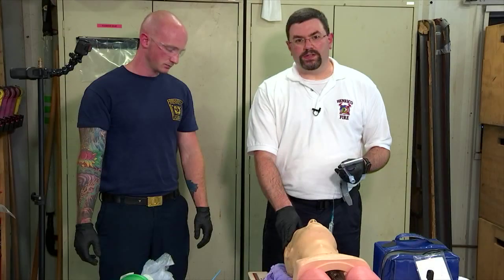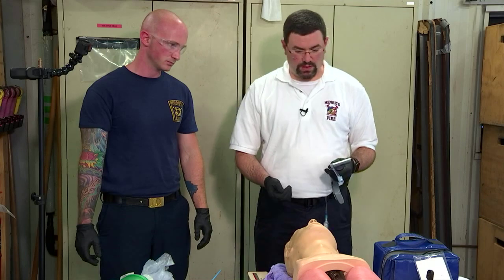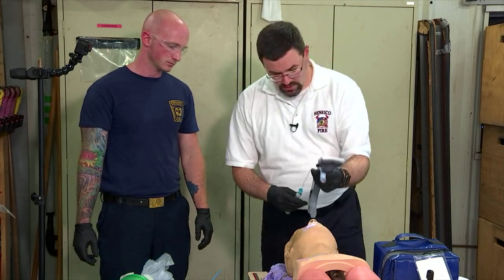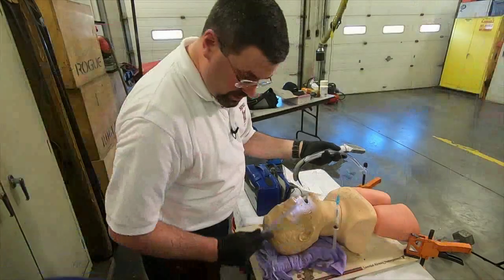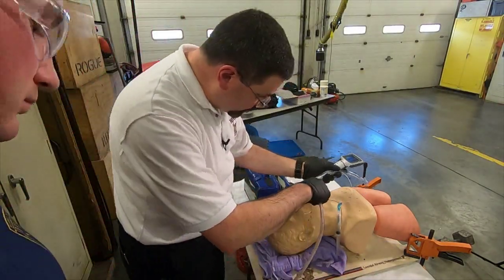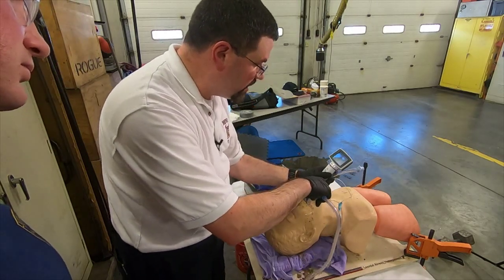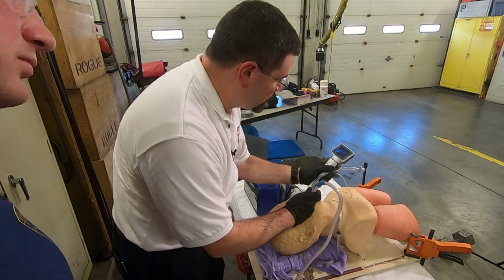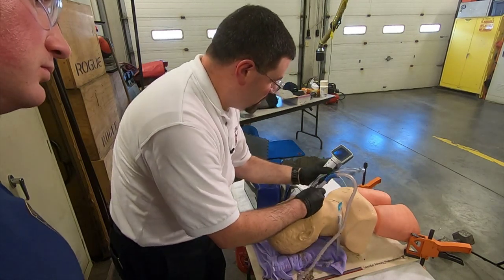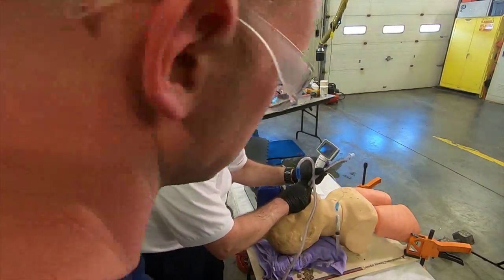Now we're going to modify the technique a little bit and use it with the King Vision. So my vomiting patient has a contaminated airway. Thank you. And I'm going to suction. If I dive this camera directly into the pool of vomit, I'm not going to be able to see anything, so I want to suction as I advance until I can see the epiglottis. Once I have good visualization of the epiglottis, I'm going to suction behind and then park my catheter again to the other side so that it's in the top of the airway.